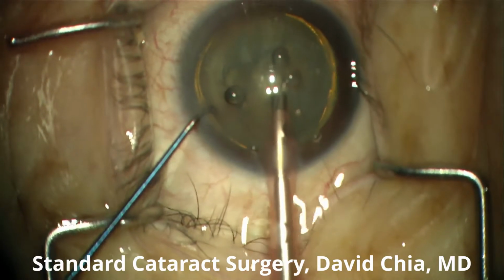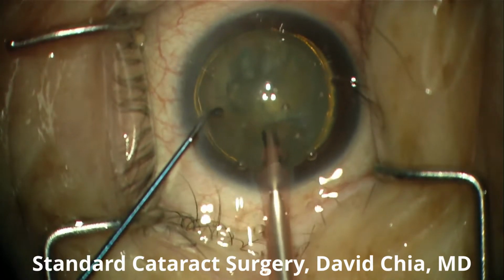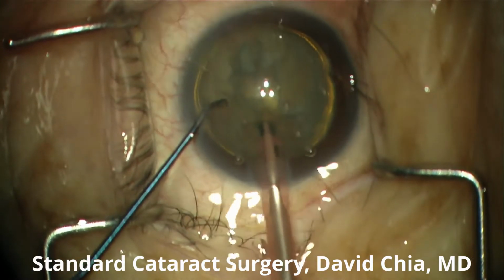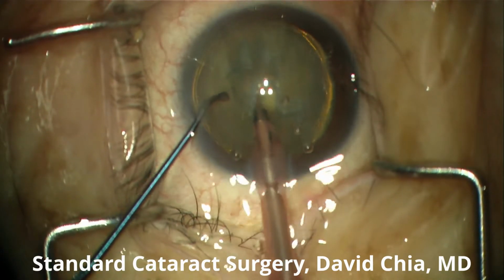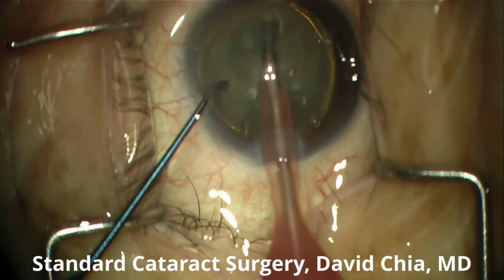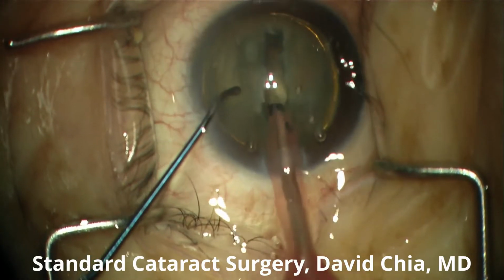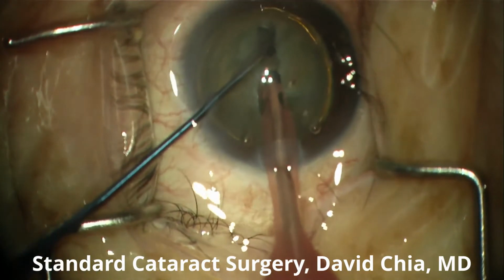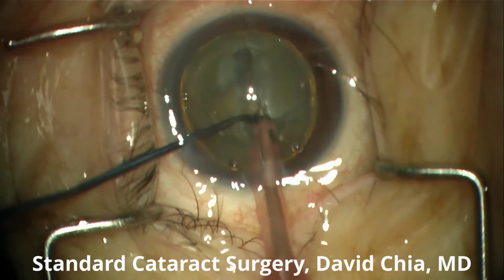We're basically breaking the cataract into very small microscopic pieces. And this is how we're able to remove a 9mm lens, which is 5 millimeters in thickness, through a 2.4 millimeter incision. So now we've created a central groove, and the role of this is to break that cataract into smaller pieces. The harder the nucleus, the more pieces we need to break this up into.